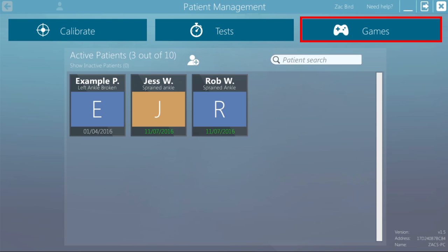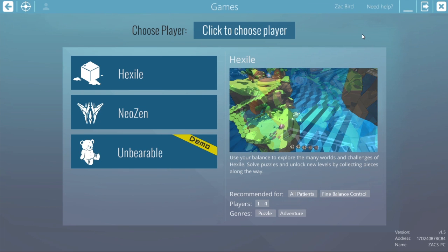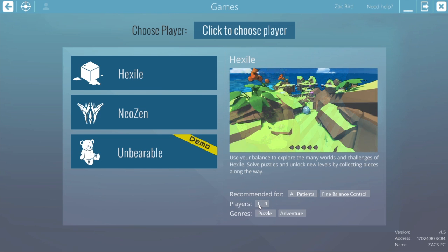To reach the game's launchpad, click Games from the home screen. The Swibo Tilt games are designed to help make exercises fun and easy to engage with. They are all built for single or multiplayer and collect data on patients' balance and activity.